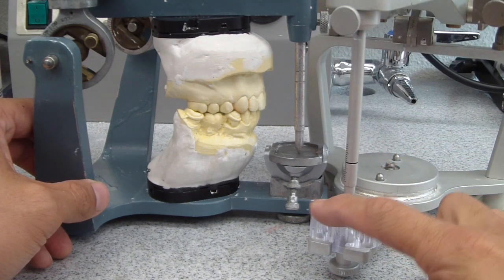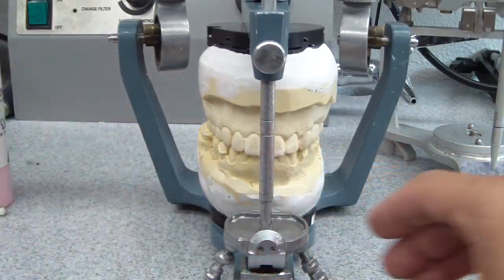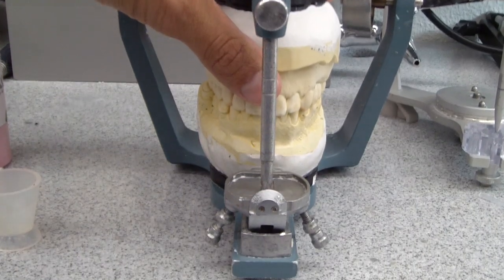Normally we do it on a little plastic block like this in a Whip Mix. However, we don't have many articulators with Whip Mix and everything's been established on the Hano, so this is one way of doing it for the Hano.